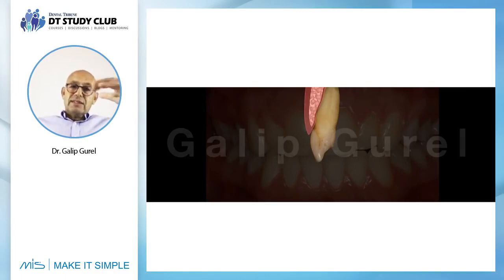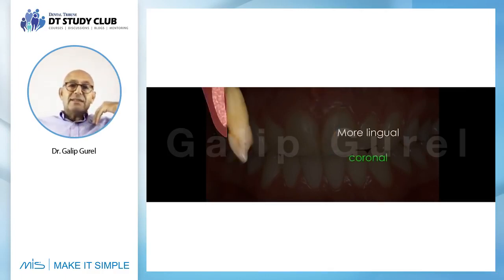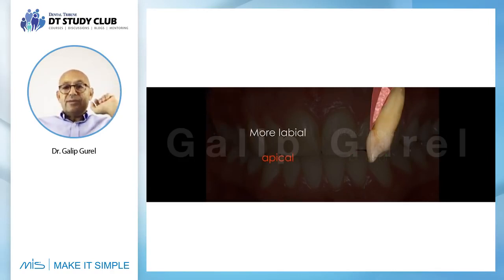If for some reason this tooth is palatally bended, tilted, more likely the soft tissue has a tendency to grow coronal. On the other side, if it's flared out, it's most likely that the soft tissue will go apical. And we can easily see it when we're shaping the contours of our restorations that sit on the implants. If we exaggerate this, immediately the tissue escapes.